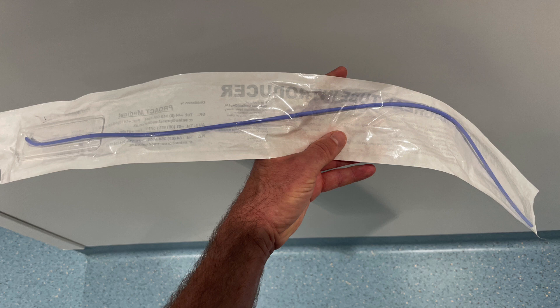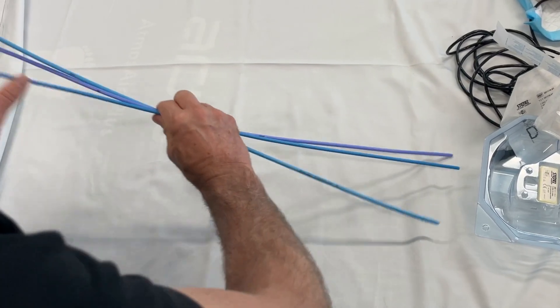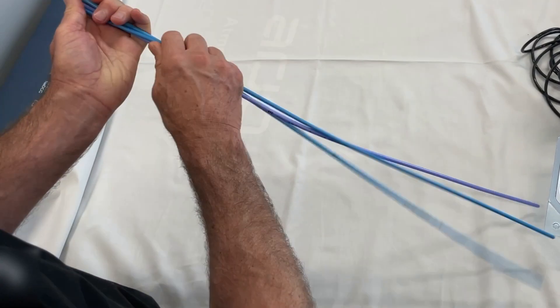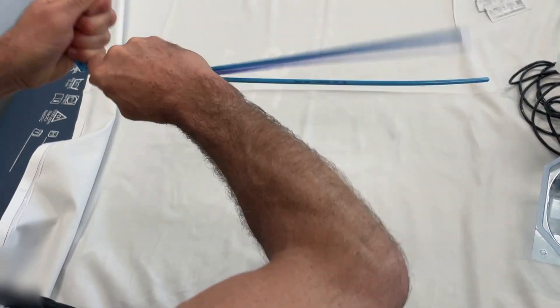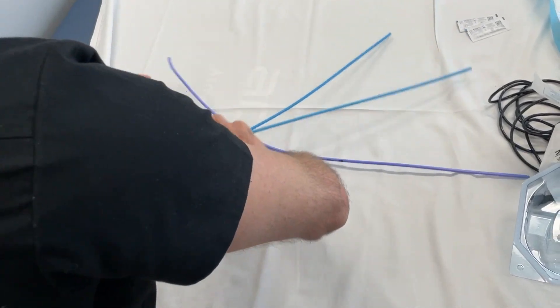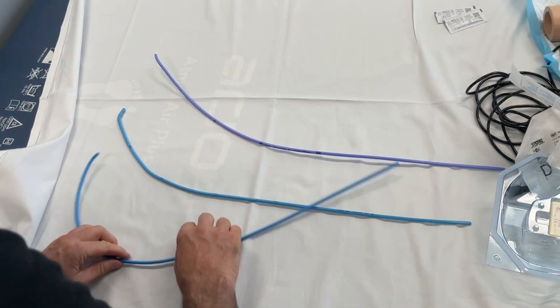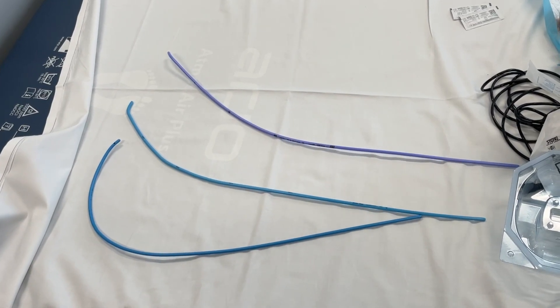One of the things you might want to do with a bougie is put a bend in it to adapt it to your particular patient's needs. Here's a comparison of putting a bend in three different types of bougie — the ProBreathe at the top, then the FlexiCare, and then the standard Frova one at the bottom.